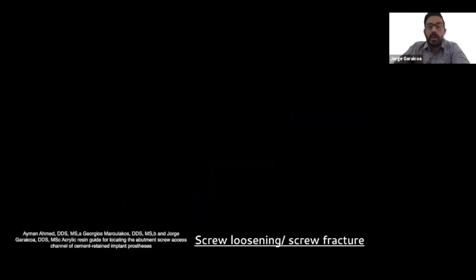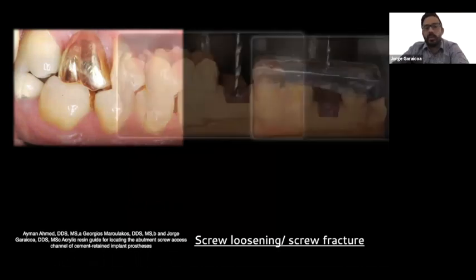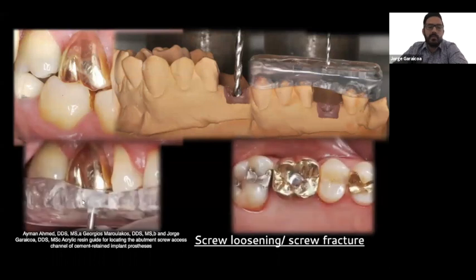Another way to do it is from an article that we published a couple of years ago. I had a patient with a cement-retained crown on a posterior tooth, and since I made the crown myself, I had the master cast. You can put that on a surveying table and create a PMMA acrylic stent, drill through it, take it to the patient's mouth, drill through the stent, and then create an axis. This can be really helpful, and that's why, even with a single restoration, I want to keep the master cast for as long as I can, just in case I need it someday, right?